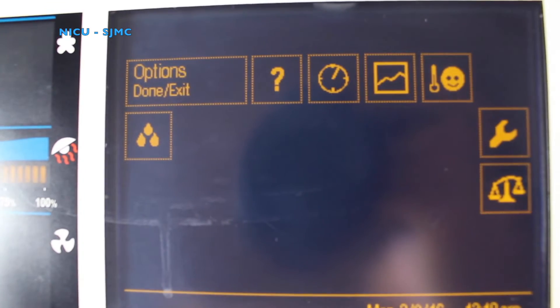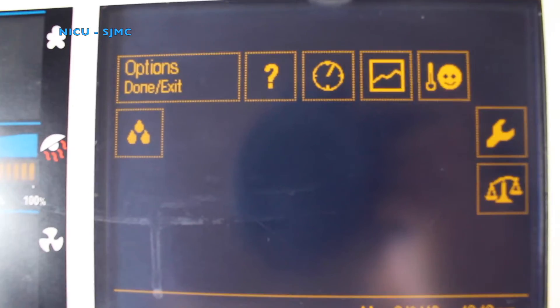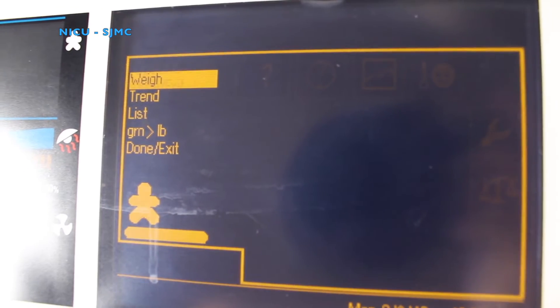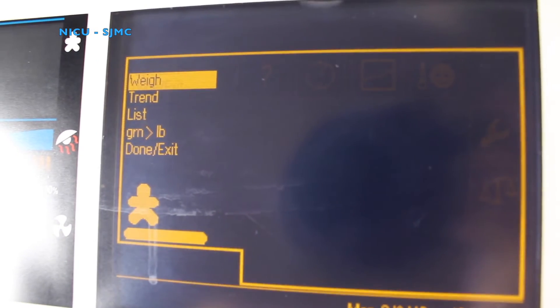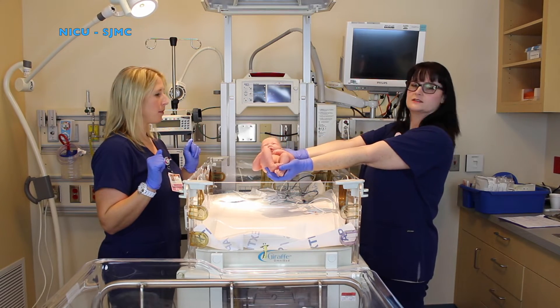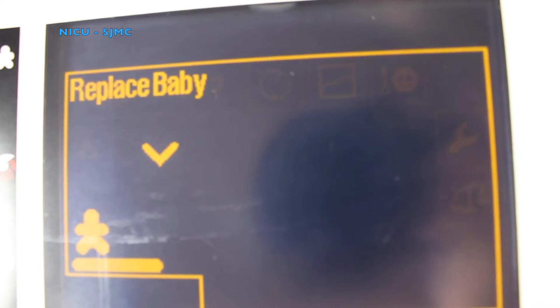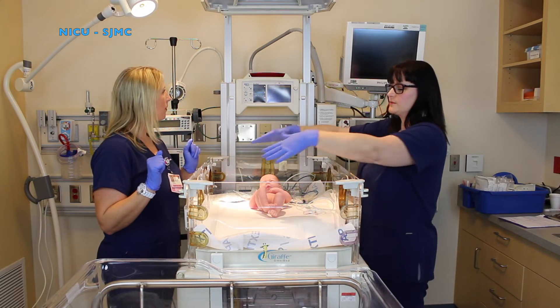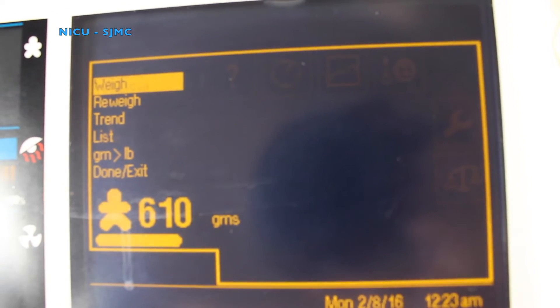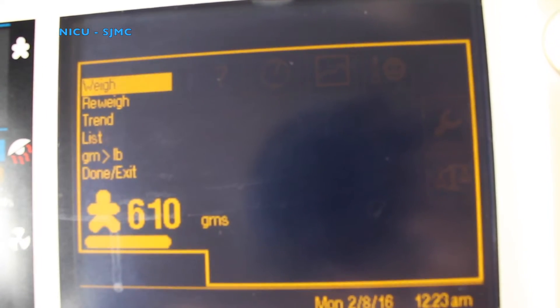To weigh your baby, you're going to scroll through your giraffe screen down to your scale. It's going to say 'weigh baby,' so you press for the weight. Follow the directions — you wait at the side without touching the bed. Then follow the directions on the screen which says 'lift baby,' so you lift your baby. Hold your baby until the bed tells you to replace. Once the baby is replaced on the bed, make sure you don't touch or lean on the bed and it will give you the weight. Our baby is 610 grams.